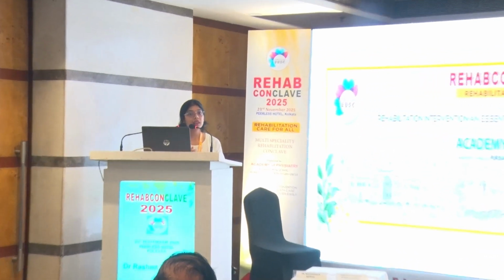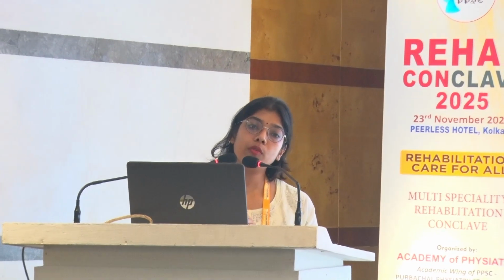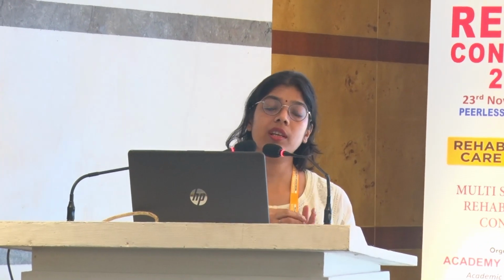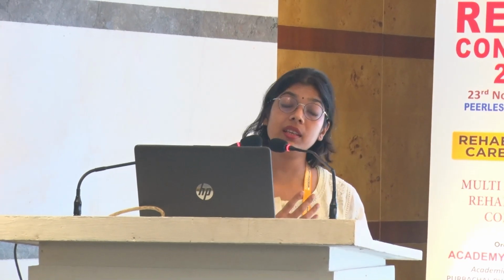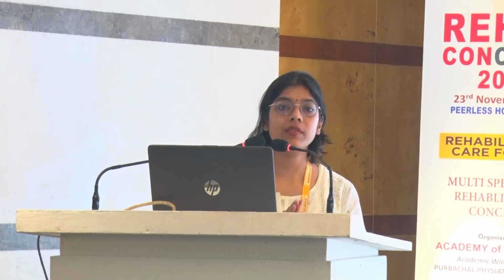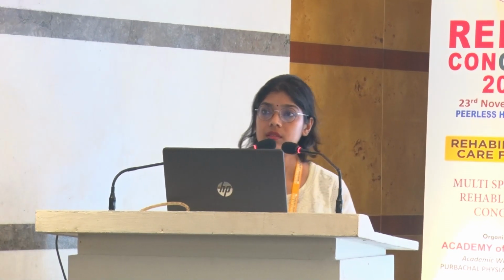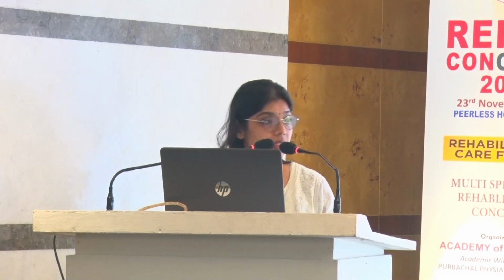Sir, erosions will take at least 3 months to develop. Before that, in early arthritis, we look for synovial proliferation and vascularity. Even tenosynovitis develops early, but erosions usually develop only after 3 months, in untreated cases.